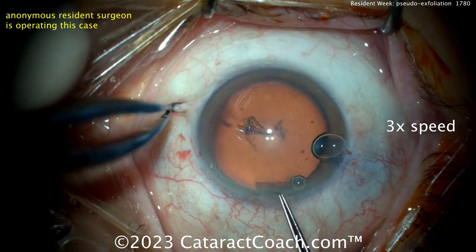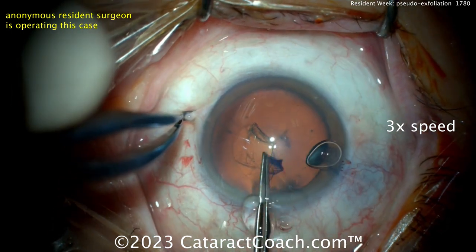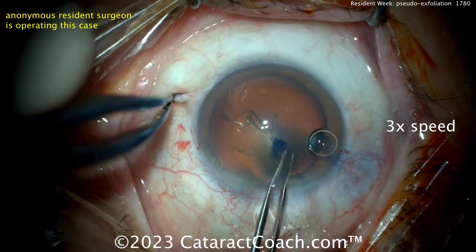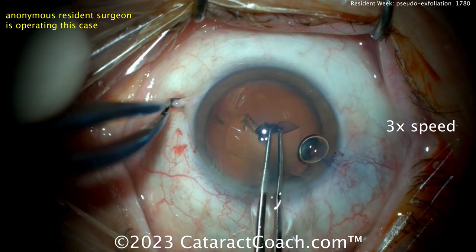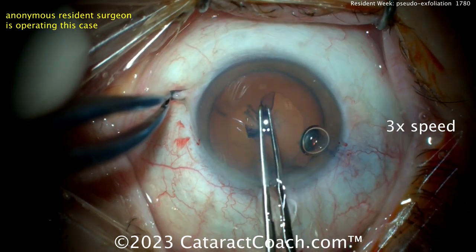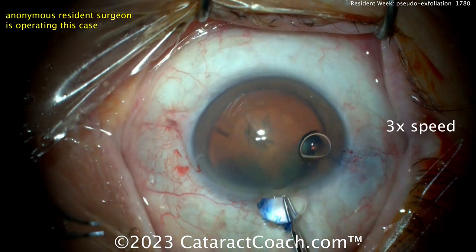The resident is starting off, fixating the eye with 0.12 or Colibri forceps in the left hand. You've got to be careful with this because you're going to induce a subconjunctival hemorrhage in some patients, and that takes away a little from the patient experience. It won't affect the visual outcome at all, but it does affect the patient's experience. There's a rhexis — a beautiful rhexis, by the way.